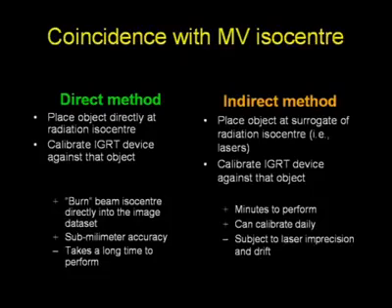However, the unfortunate thing about this direct method is that it takes a long time to perform. A seasoned user may take 2 hours of his day just to perform this method.